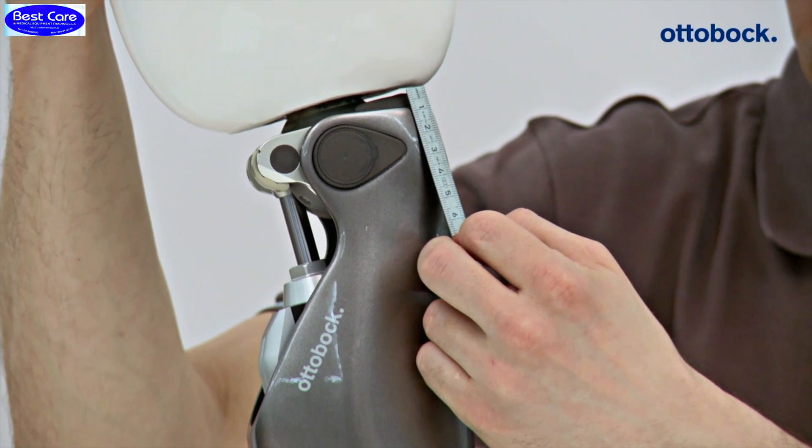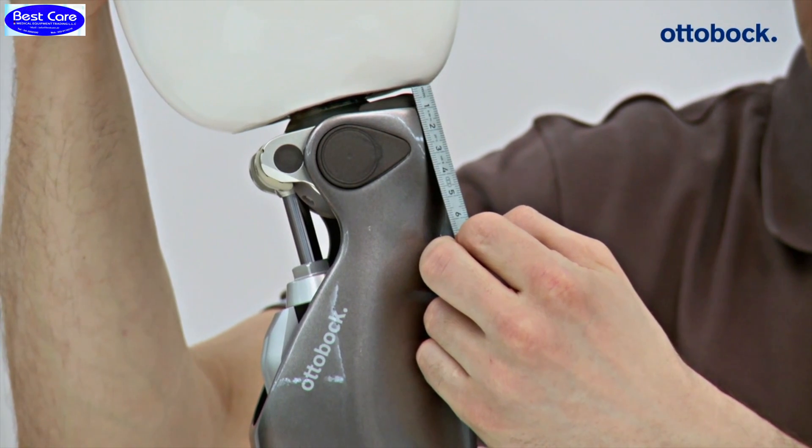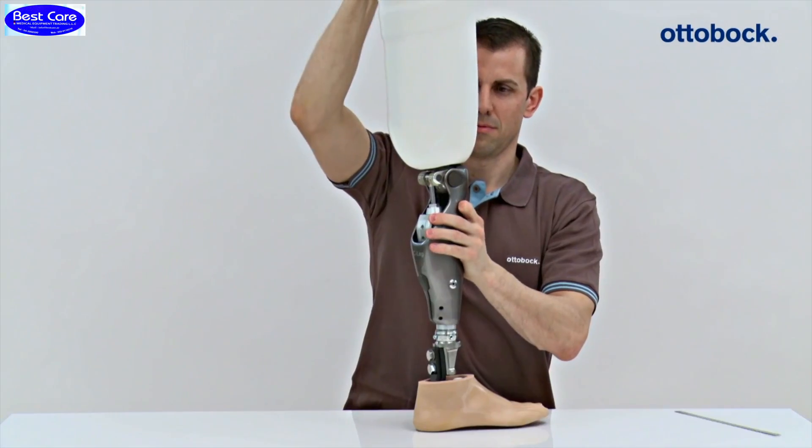Even if there is still space when the knee is extended, collision and therefore damage to the main electronics of the knee joint may still result when weight is placed on the prosthesis.